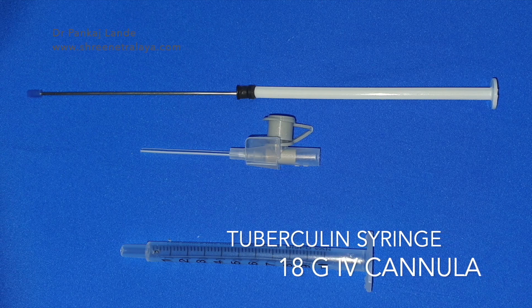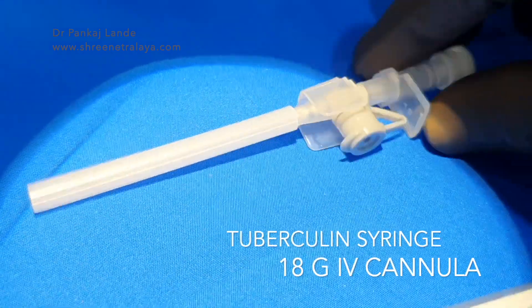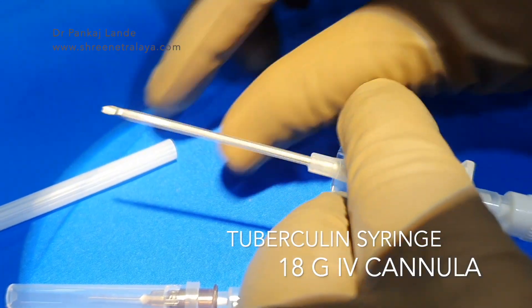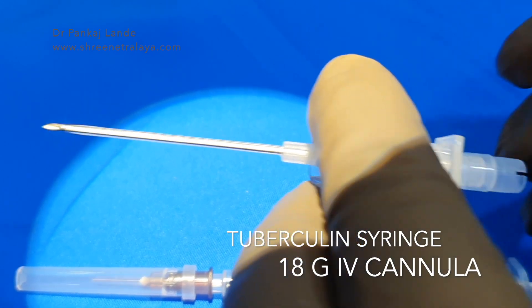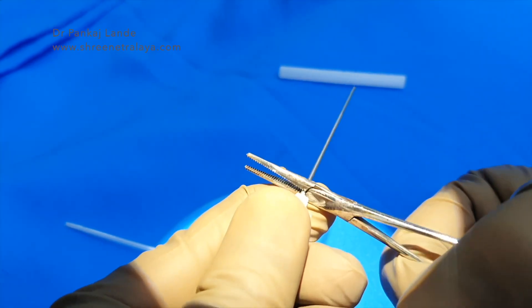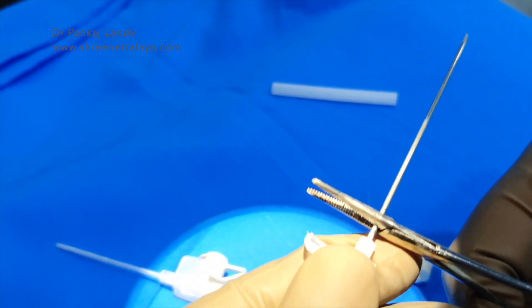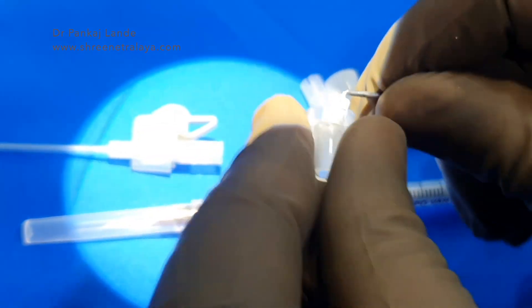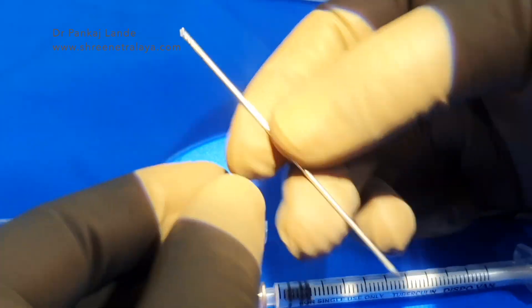Now let's look at the steps to prepare this. First, the metallic inserter of the IV cannula is taken out — it has to be broken. With an 18 gauge cannula you can directly pull this metallic part and it will come out. You can just twist the metal and it will break. Now we have a separate metal inserter for our injector system.